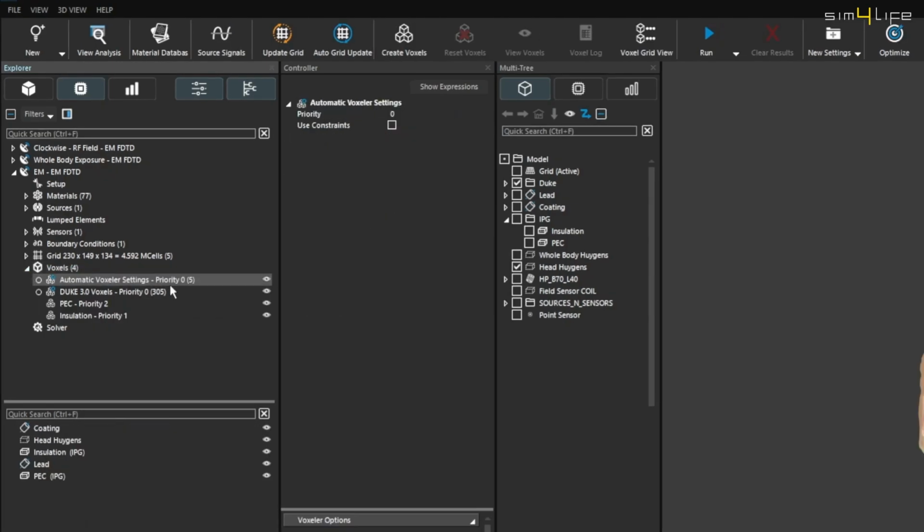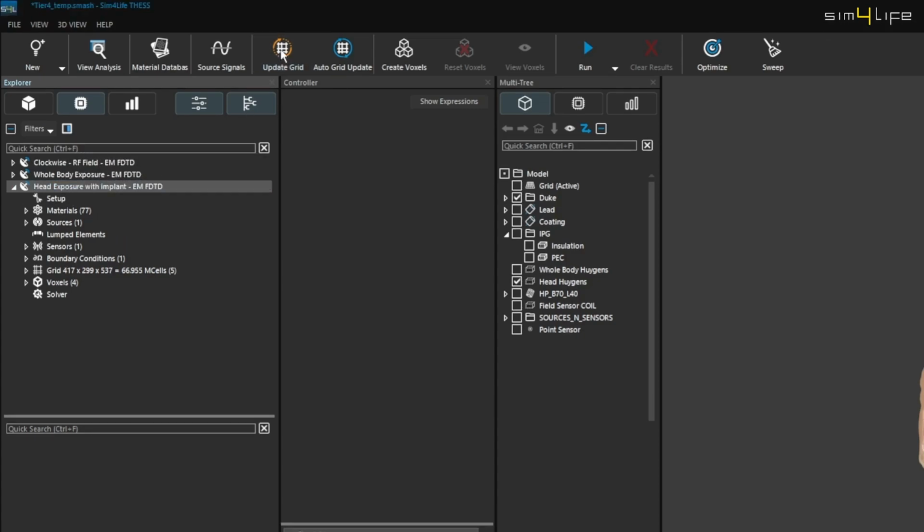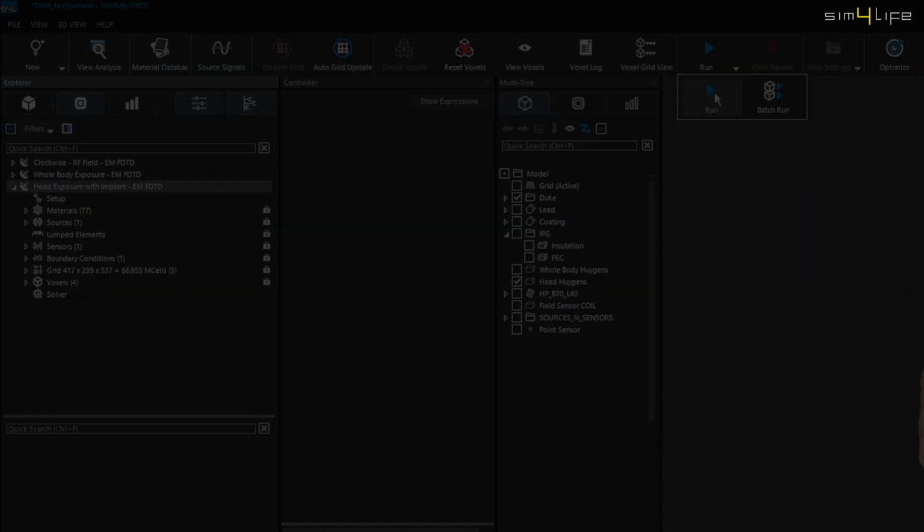Considering that entities with a higher voxelization priority will be constructed first, we assign the highest priority to the most inner parts of the implant. Subsequently, all metallic parts will be assigned the highest priority, whereas Duke's voxelization will be automatically handled by Sim4Life. We rename the simulation to Head Exposure with Implant, update the grid, create voxels, and run it.